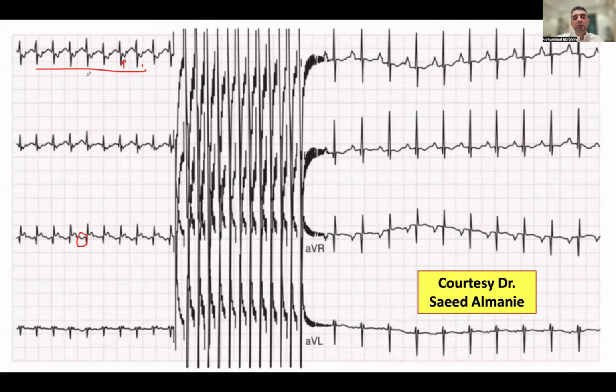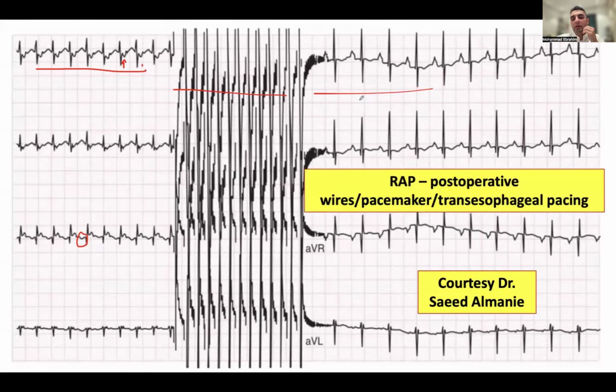But anyways, it's not sinus tachycardia. We think it's more likely SVT. The patient had atrial wires, so they rapidly paced the atria, and the ECG changed to normal sinus rhythm. That's an example of atrial pacing terminating an SVT.